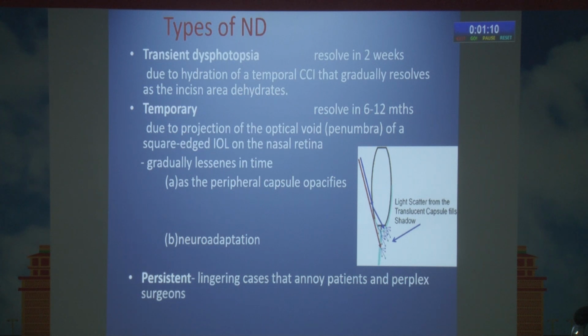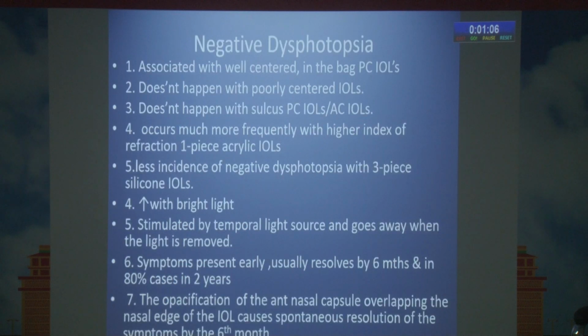But it is the persistent variety, consisting of lingering cases, that annoys the patient and perplexes the surgeon. So I told you it occurs with well-centered in-the-bag PC IOLs. It does not happen with poorly centered IOLs. I'll just take a minute, sir.